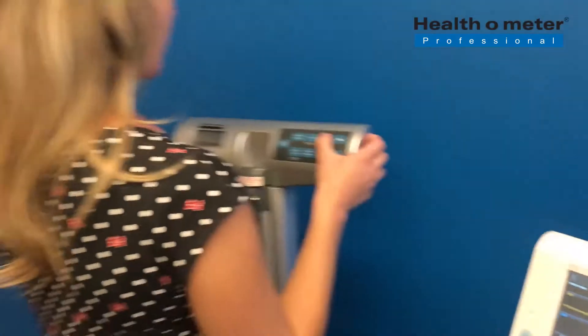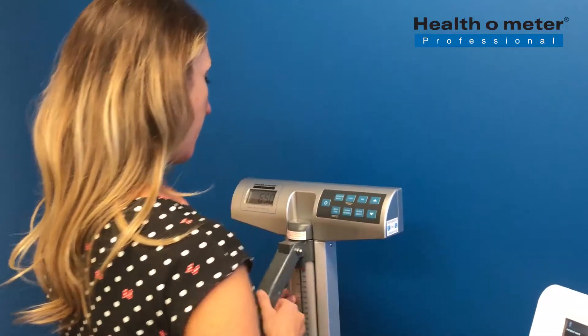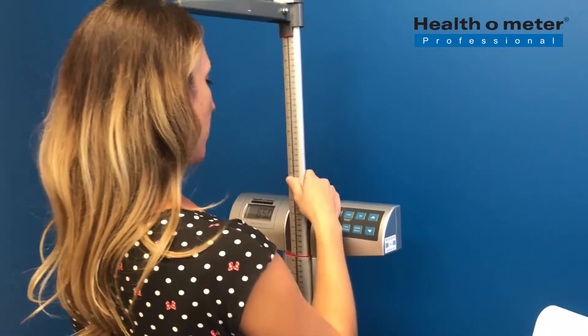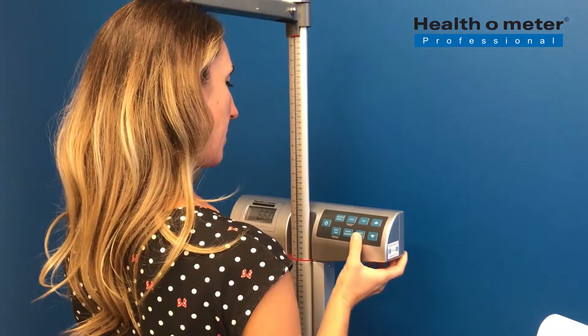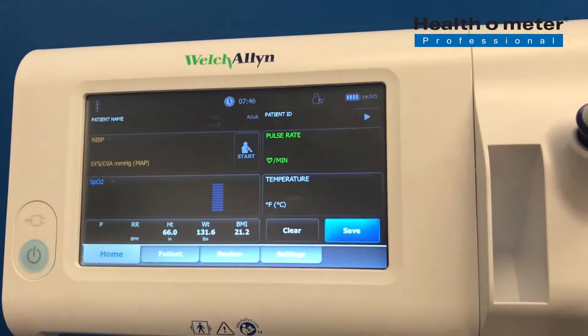Press BMI on the scale, then use the height rod to measure the patient height, and then use the arrows to enter the height. Press Enter, and the height and BMI will appear on the Welch-Allen Monitor.